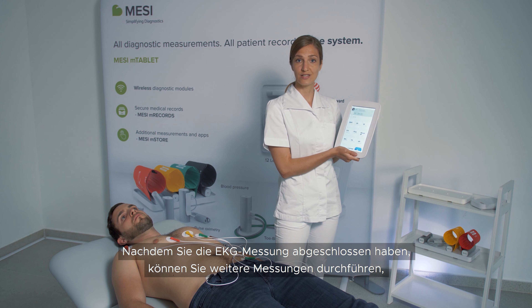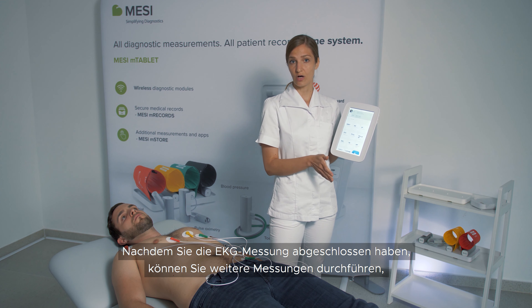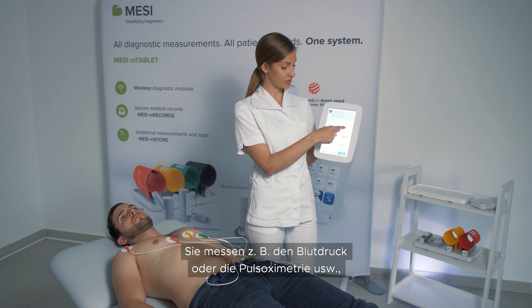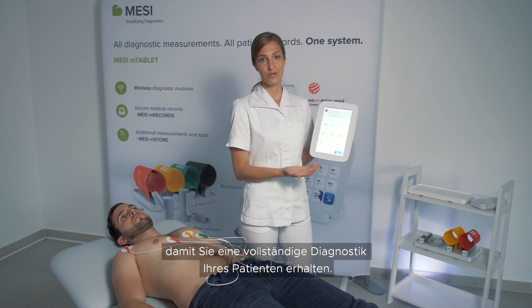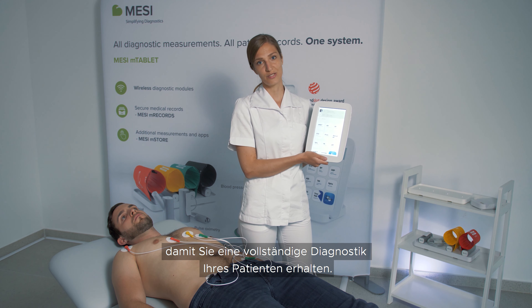After you are done with the ECG measurement, you can also perform other measurements such as blood pressure, pulse oximetry, and so on. So you can receive a full diagnostic of your patients.